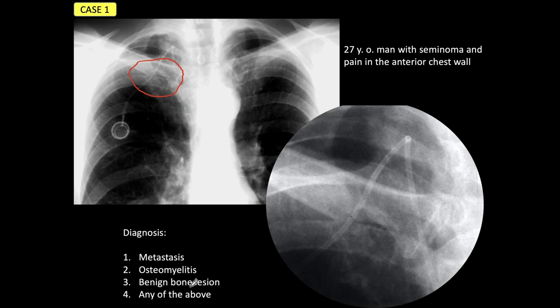Is it a benign bone lesion? Or if you cannot make up your mind, you can say any of the above.